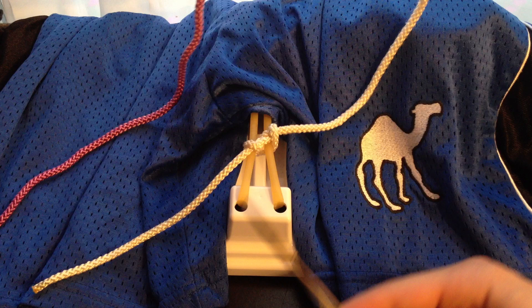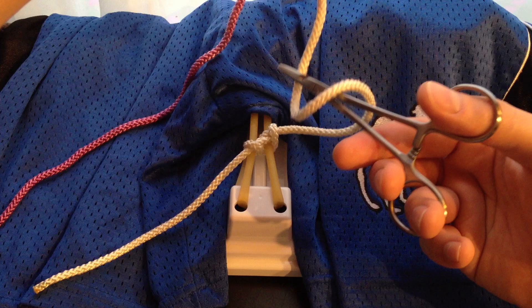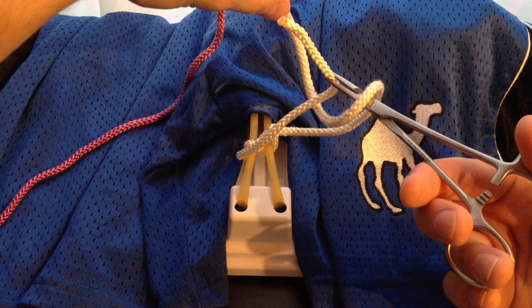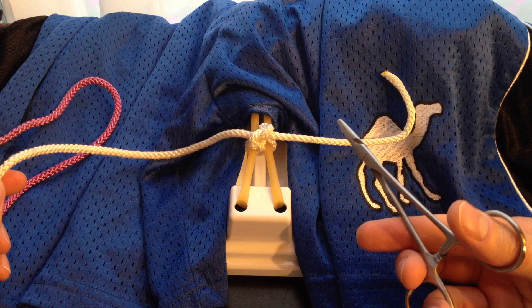To tie the second knot, it's essentially the same. Again, start with your needle driver parallel to the incision. This time, we're only going to do one loop. From here on out, we do one loop — two loops are only for the first knot. So we do one loop, grab the thread as close to the tip as possible, and we pull it through. We picked it up on the left, so to pull it tight, we tighten it to the right side. And that's our first square knot.